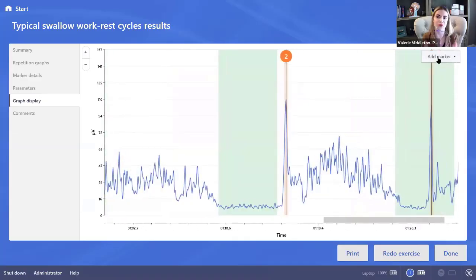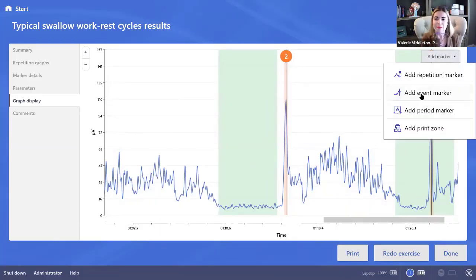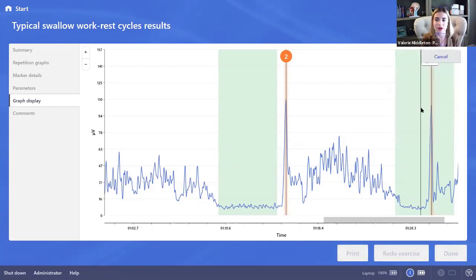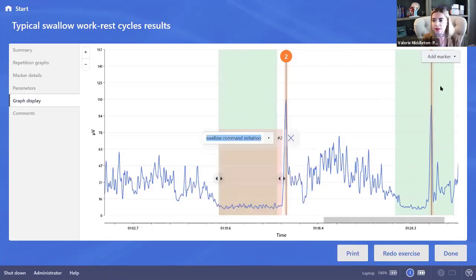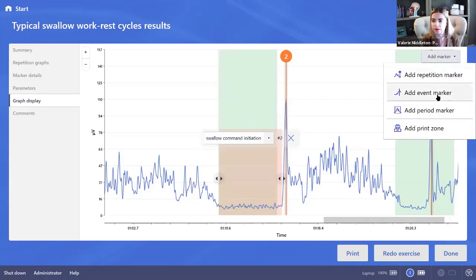You don't have to do this for all of yours. It's just as simple to know the time component that you put in there and then be able to look at how many are within the green. I think that's the simplest way to do it, but I did want to show you this in case this is something you're interested in utilizing to get even more specific information. So we'll just try that for a couple of these so we can see what our average is. And we'll do one more here.